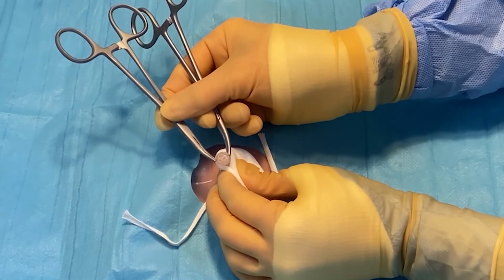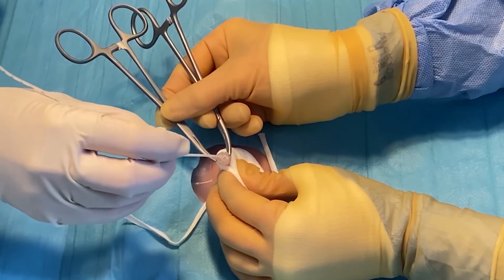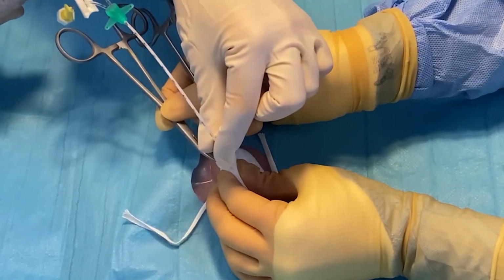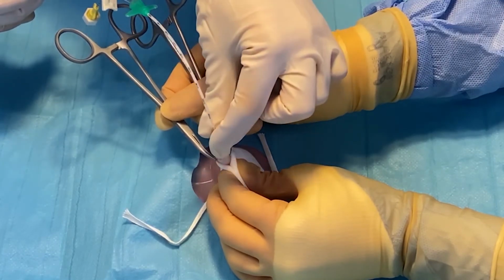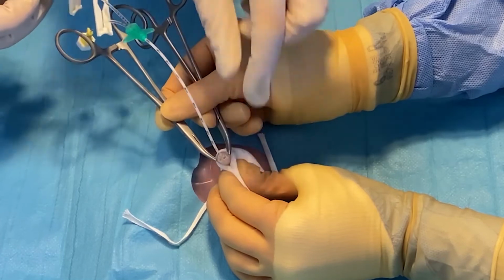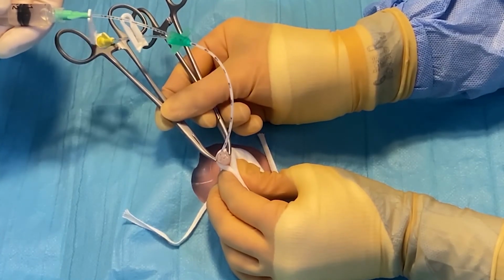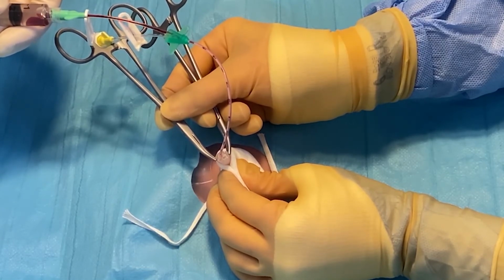Then with my primed catheter, I'm going to gently insert it to the desired length. And there's numbers on the side to assist with this. Once I'm happy it's in the correct length, then I'm going to aspirate, and if it's in the correct place, you'll see that blood easily comes up the line.